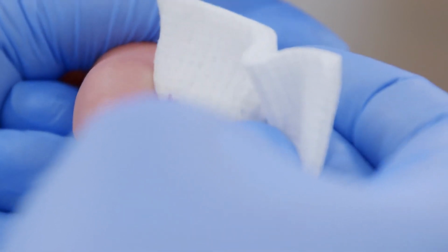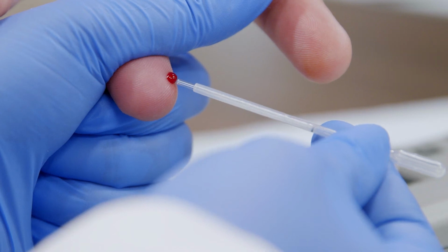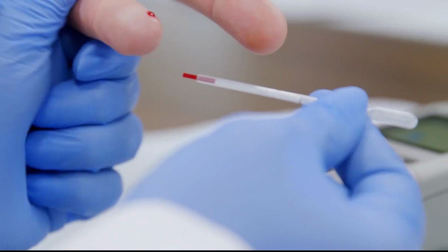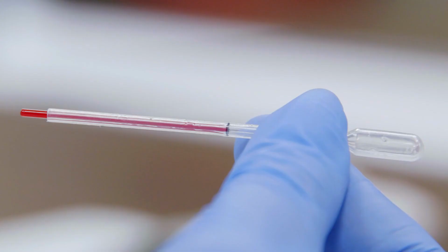Wipe away the first drop of blood with gauze and use the second blood drop for testing. The blood drop should be hanging down from the finger to make it easier to collect the sample with a pipette or capillary tube. Gently apply intermittent pressure to the finger until you've reached the fill line marked on the capillary tube.